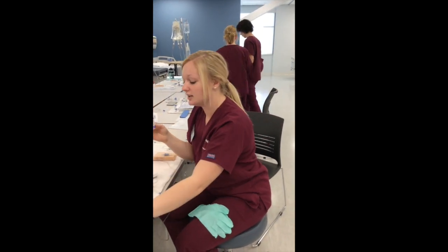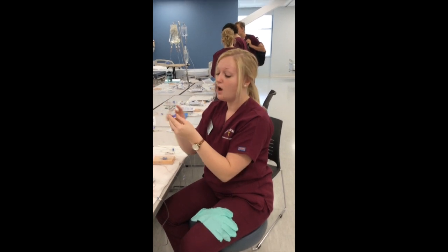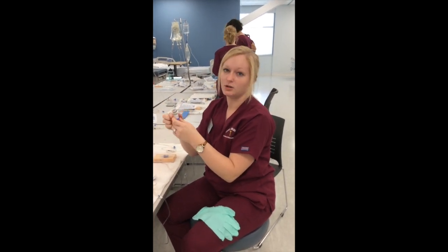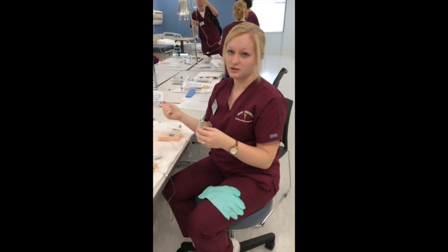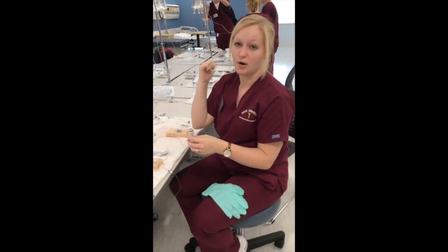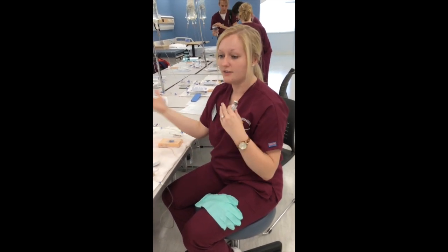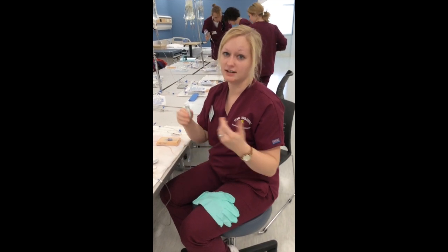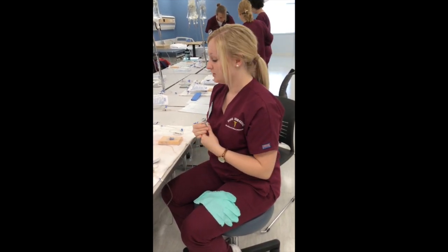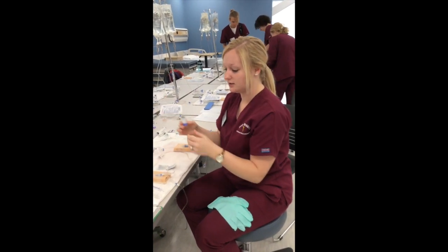So I see that my patient is going to be receiving 2 milligrams of morphine, and it comes in a vial, 1 milligram per milliliter, so I'm going to be drawing up 2 milliliters, okay? Since these are single dose vials, I'm going to draw up all the medication that's in it, and if there's more than what I need, I have to have another nurse witness my wasting of the medication because it is a Schedule II. So I'm going to check for the first time, yes, this is morphine, the right concentration and everything.